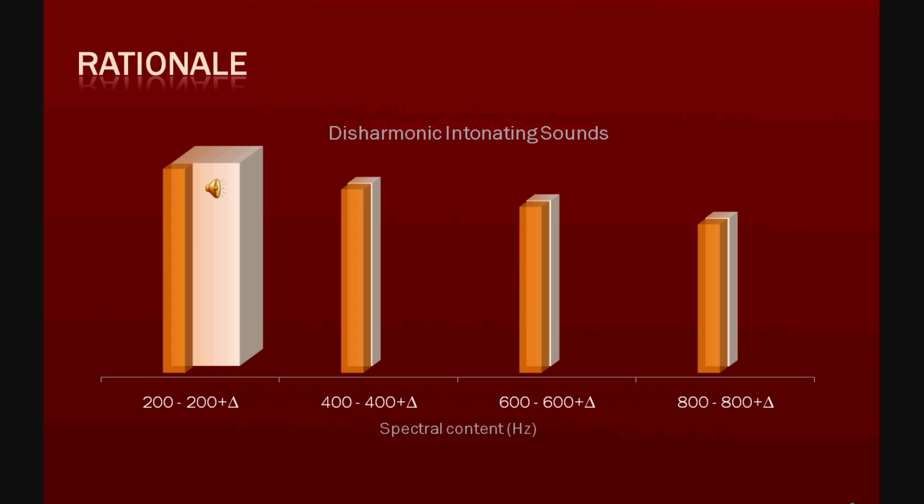However, the frequency of the harmonics does not sweep accordingly. This causes the perception of disharmony. Now the cue for discrimination is only contained in the low frequencies. Again, the algorithm changes delta in an adaptive way and converges to find a threshold, or JND.